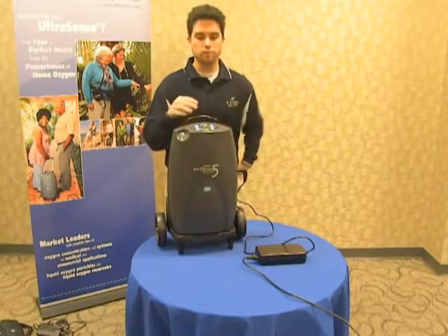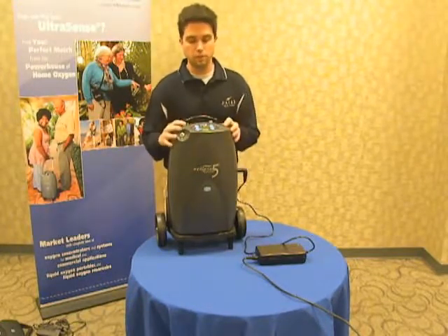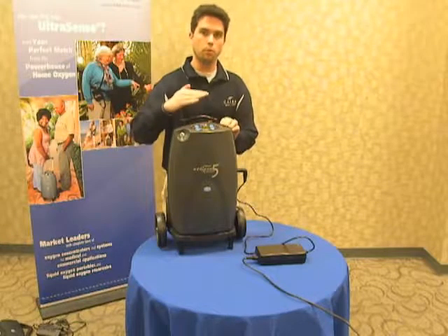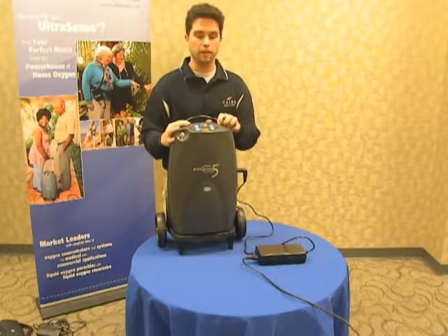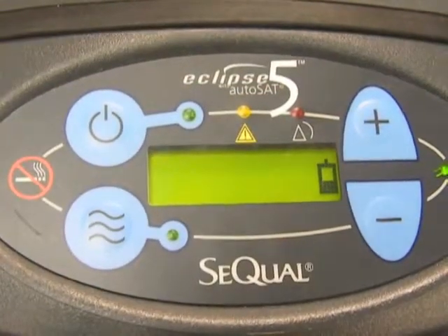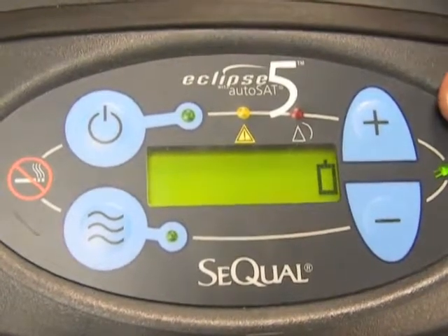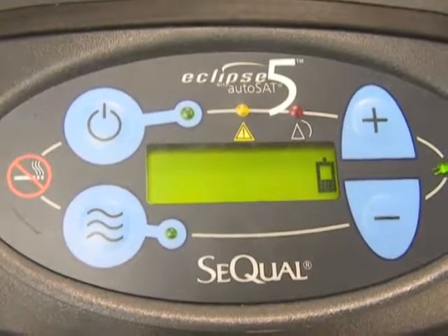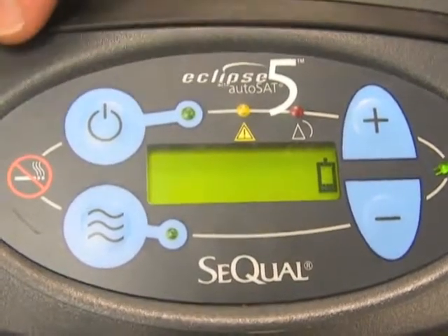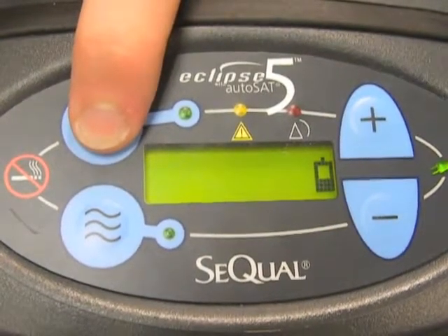So at this point, now that we're plugged in, the battery has begun to charge. As I mentioned earlier, you can see that because the actual bars of the battery are cascading or waterfalling up and down. Let's take a look at that here. Now that the unit is connected to AC power, indicated by the light over here, and the battery is charging, we are fine to go ahead and turn on the machine. To turn on the machine, hold the power button down for about 2 seconds and release it.